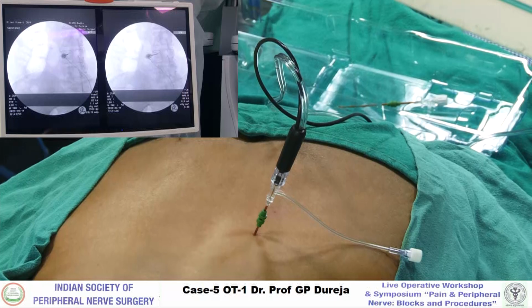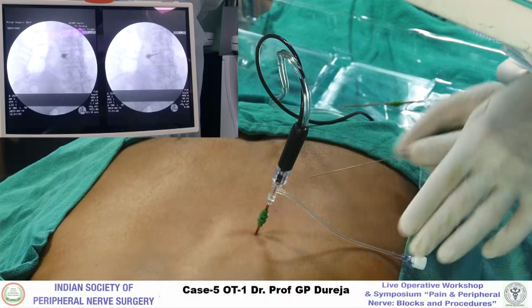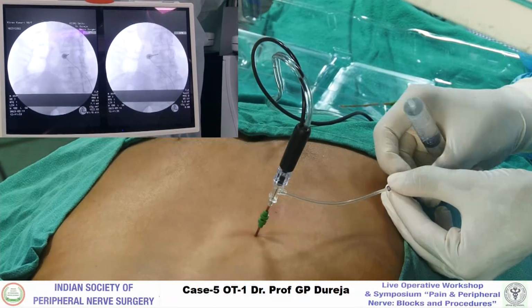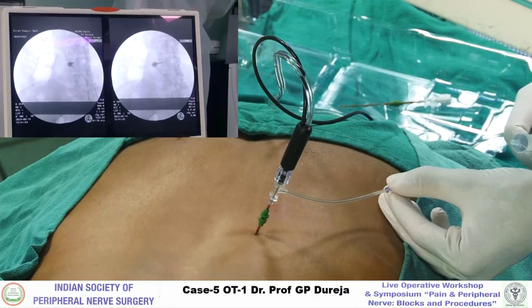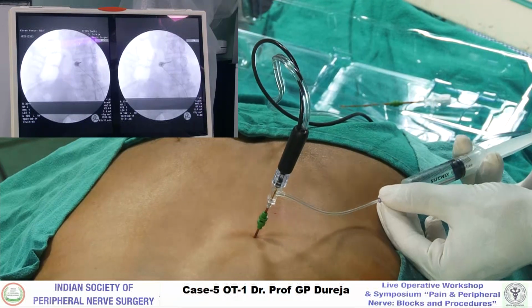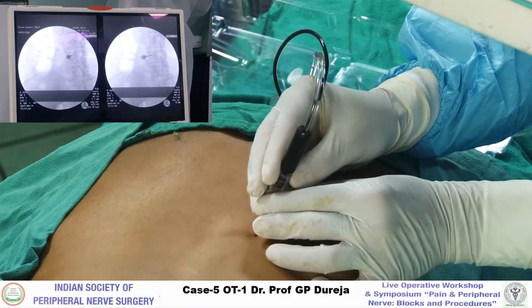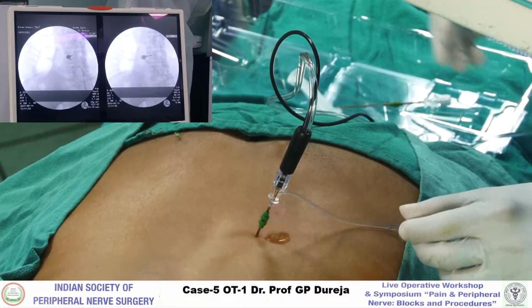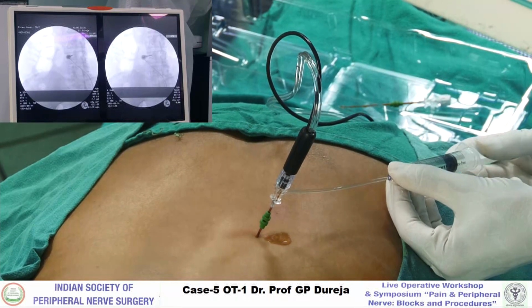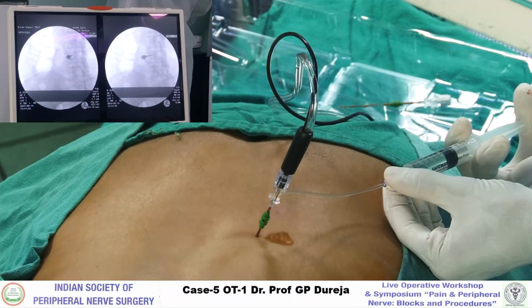चलो एक मिनट में आपको वो भी दिखा देता हूँ जो स्टैंडर्ड आरएफ दिखा भैया. एक मिनट. हाँ एक मिनट. अच्छा दे दो. बंद कर दीजिए मोटर. अब बस. ज़्यादा मत देना लोग. बस बस enough.